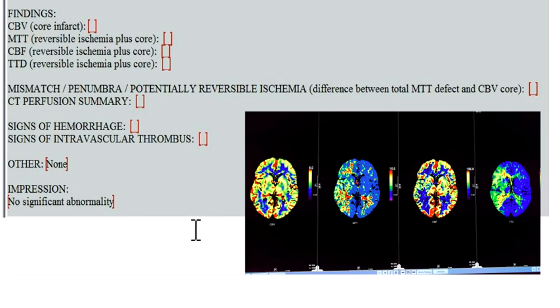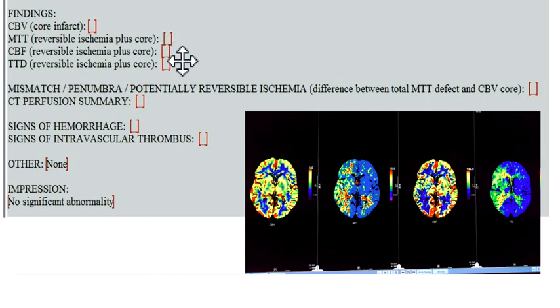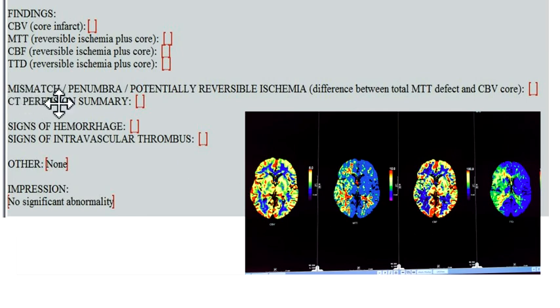Then fill out the report template. List the findings on the four sequences. For CBV core infarct in this case, you'd say normal or no defect. For MTT, you'd note large MTT defects throughout the entire right middle cerebral artery territory. For CBF and TTD, you can basically copy and paste since findings are similar. For the mismatch, you'd say there's a large mismatch defect on the right with no underlying core infarct. Your CT perfusion summary: large area of potentially reversible ischemia throughout the right MCA territory with no underlying core infarct.